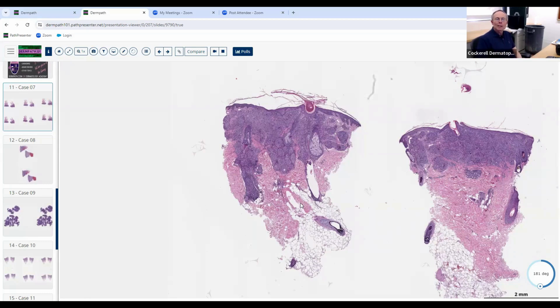And so when we see that, we ask ourselves, what is the cell type that we see in this nodular and diffuse inflammatory process? And at low magnification, say, well, there's some dark cells in here, so there's going to be some lymphocytes. But notice that there's also a whole lot of these pale cells in here. So obviously, whenever we see pale, I want you to be thinking histiocytes.